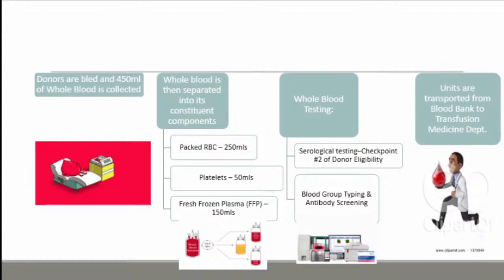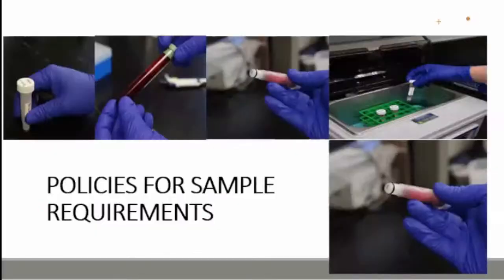So once the blood is transported from blood bank and checked into the transfusion medicine unit, it is ready to be cross-matched for patients on the ward. Next slide, please. So let's look at some of the policies that govern transfusion medicine, beginning with sample requirements.